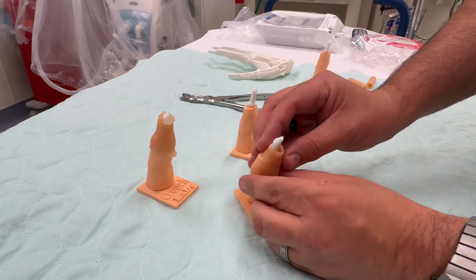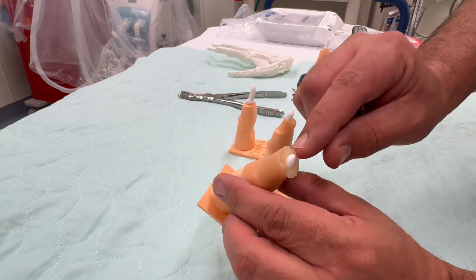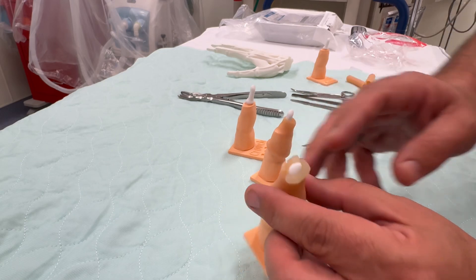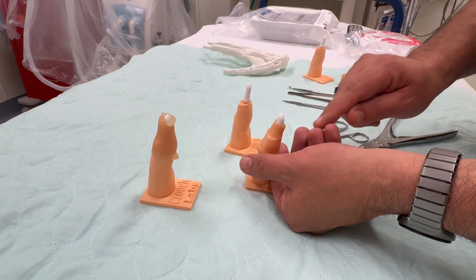When you cut the tip, you'll see that the silicone will retract leaving the bone exposed. In this scenario, when you're looking at a finger that has been amputated this way and the bone is sticking out, you do not have adequate soft tissue to close over the bone, so you will need to take a rongeur to grind it back.